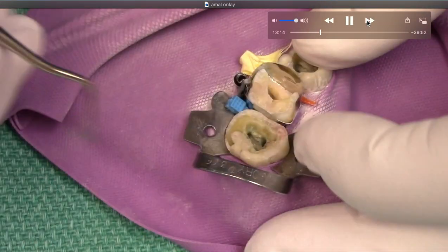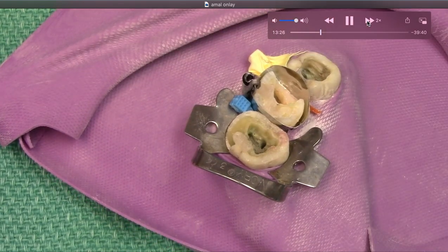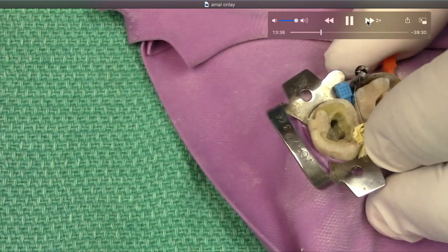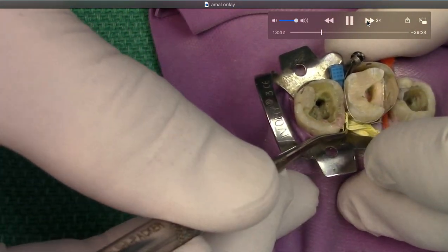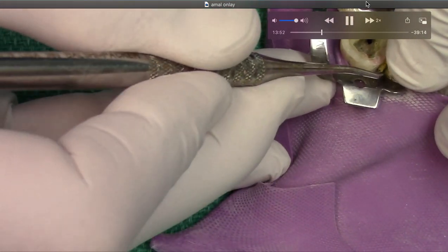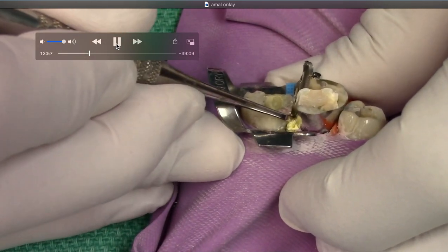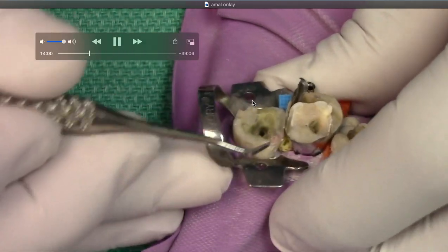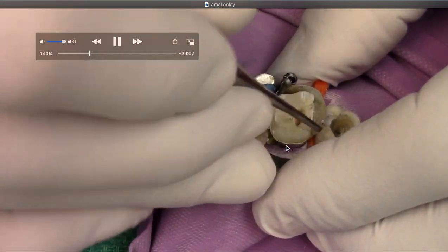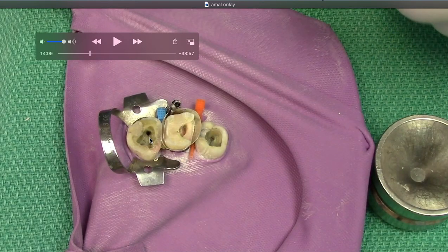You can see we're packing it in there, and it's amazing because it holds shape. Try using this as retraction cord — it works in about 85% of cases. It's amazing: just keep packing it in the sulcus. There's our preparation. We're going to take our amalgam, break open the capsule, and resist the temptation to throw it all in at once.